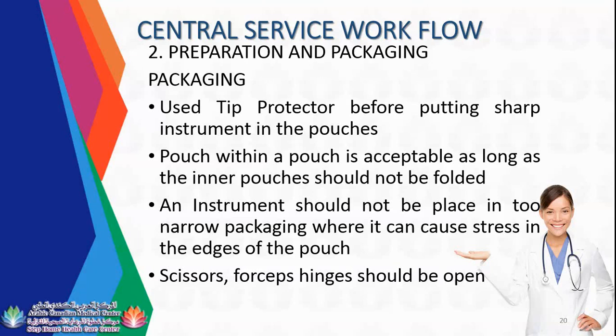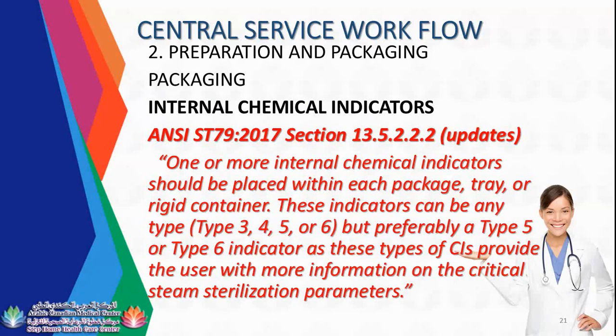So scissors and forceps should be unlatched. The word is not open, it's unlatched. Please be reminded of the new updates. As per ST79-2017, one or more internal chemical indicators should be placed within each package, tray, or rigid container. Each indicator can be any type 3, 4, 5, or 6, but preferably a type 5 or 6 indicator, as this type of chemical indicator provides the user with more information on the critical steam sterilization parameters. Actually, guys, in medical centers, they are using class 4. But in the hospital, they will go directly to type 5 or 6 chemical indicator.